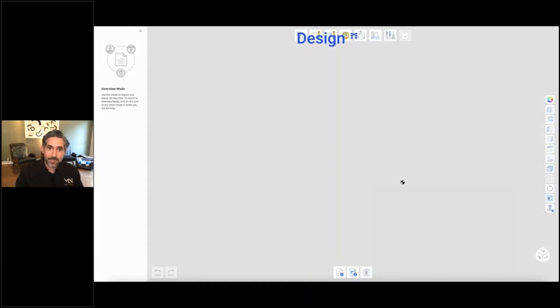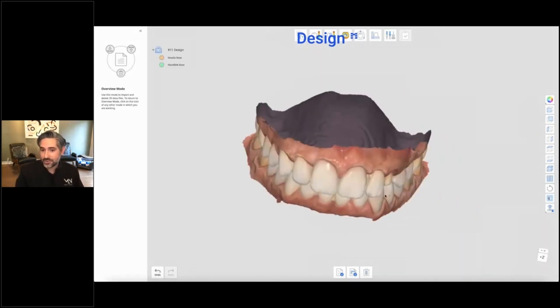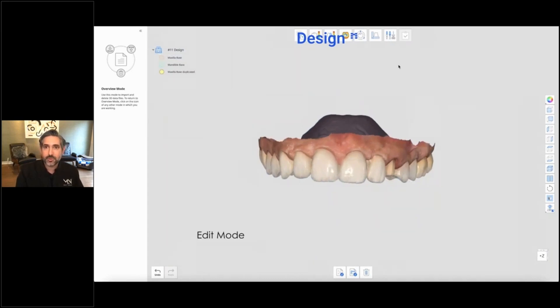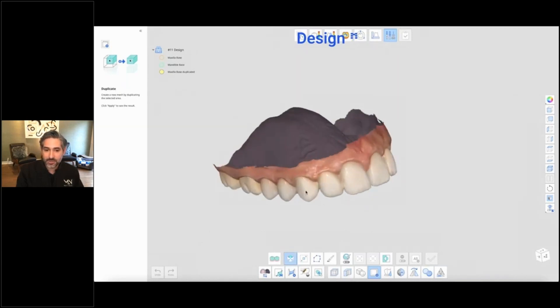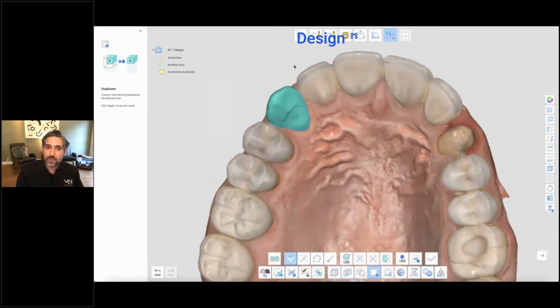I quickly did the design with my goal to have a design made before we start the procedure. So here I am in design. I brought in his upper and lower this time so I can evaluate occlusion. I like to duplicate whatever I'm working on just in case so I don't have to reopen. So I'm going into edit mode and I'm using the duplicated maxilla. Very similar process — we're going to clone, so you press that duplicate button. Then you select the tooth you want. I'm going to pick number six and refine the selection as needed.